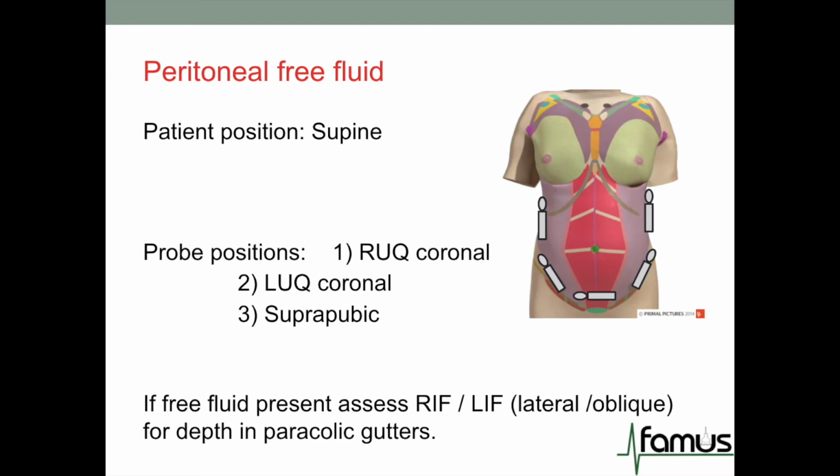So we will have information about two of the main declive positions of the peritoneal cavity, which are the Morrison and the splenorenal.